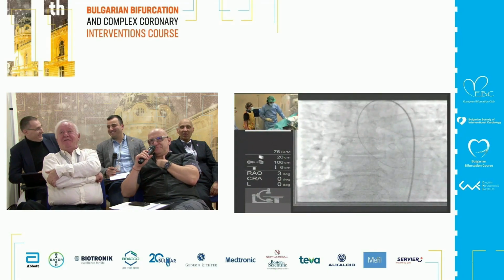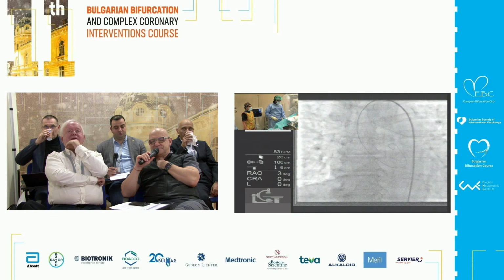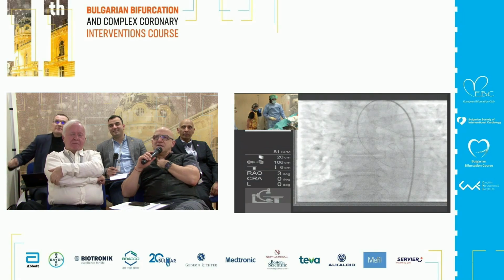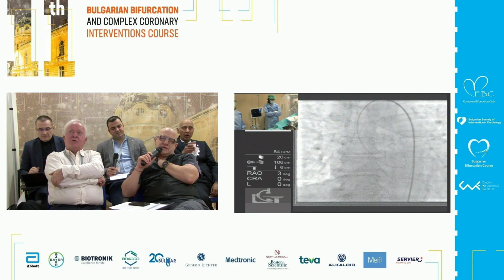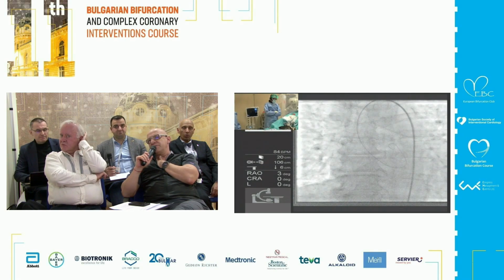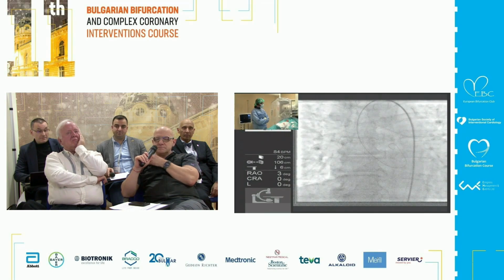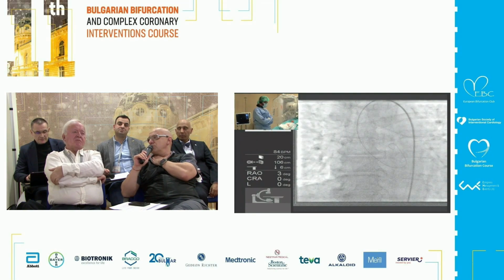We're going through the femoral approach because we don't have pulsation of both radial arteries. The lady had 2 angiograms. Anyway, this is an ostial lesion, and usually what we do in order to make our work easier is go through the femoral with 7 French because it's a big left main, and doing bifurcation and kissing balloon inflation is sometimes difficult through 6 French, especially with bigger balloons.